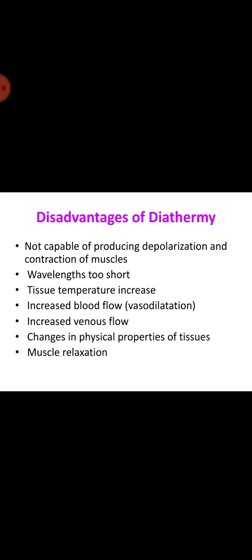A voltage of approximately 200 Vp is required to produce the electric arc between the metal electrode and the biological tissues. If the voltage is less than 200 Vp, the electric arcs cannot be triggered and the tissues cannot be cut. The voltage suitable for cutting biological tissue ranges from 200 Vp to 500 Vp, and if the voltage rises above 500 Vp, the electric arcs become so intense that the tissue is increasingly carbonized and the cutting electrode may be damaged.